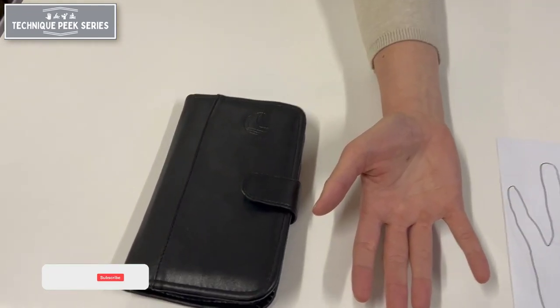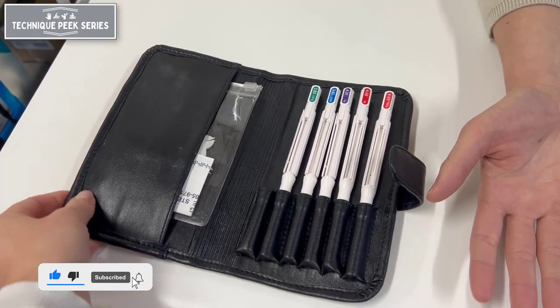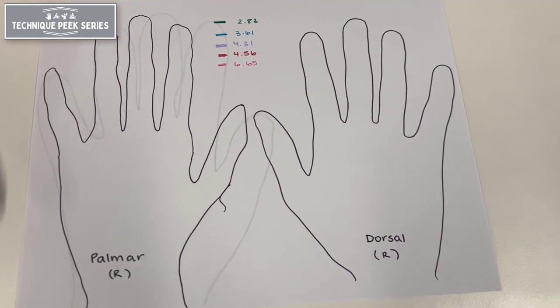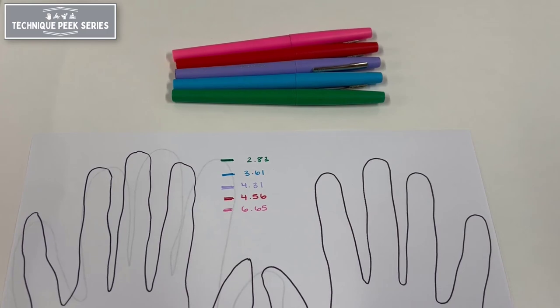Today we're going to look at how to properly implement the Semmes-Weinstein monofilament test. Consisting of five different monofilaments of varying diameters, this helps determine a patient's threshold of sensation with regards to light touch.